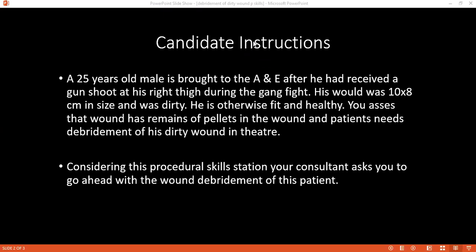What else have you missed? Once you were done, you were supposed to dispose of all the instruments that you have used. How? Please tell me. There is a sharps box, and I will throw the syringes without recapping, and the blades will be thrown in the box. There are two sharps, like needles and blades, and they will be thrown in the proper sharps box. In some centers, needle cutters are there, and you can cut the needles. It is also a method, if it is present.